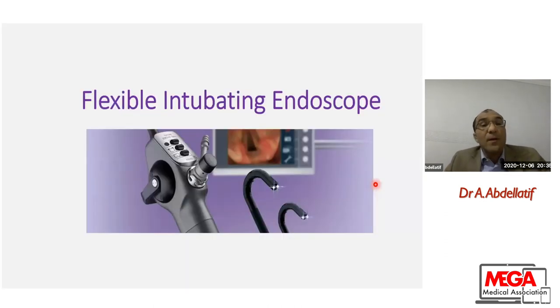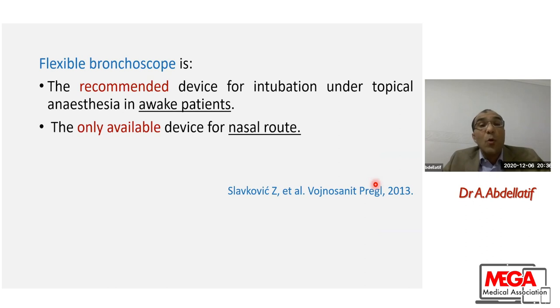We will focus in my lecture on the flexible intubating endoscope. Why flexible intubating endoscope? Because it is a special device. It is the recommended device for intubation under topical anesthesia in awake patients. And it's the only available device that allows you to go the nasal route.